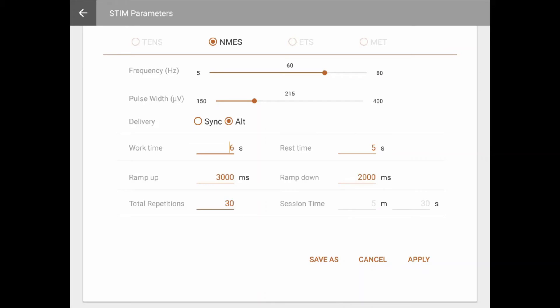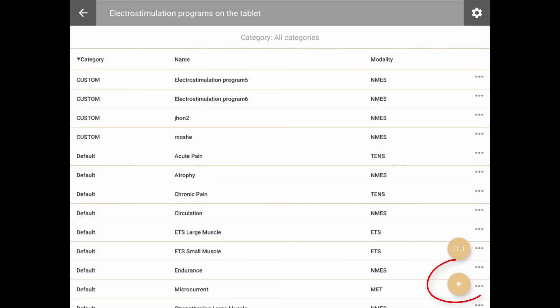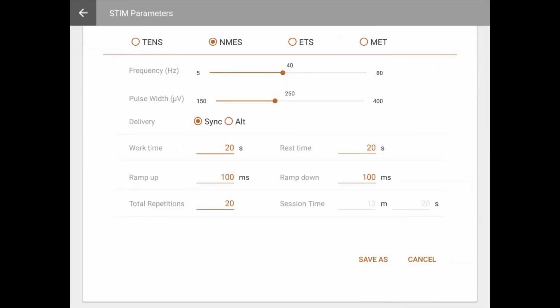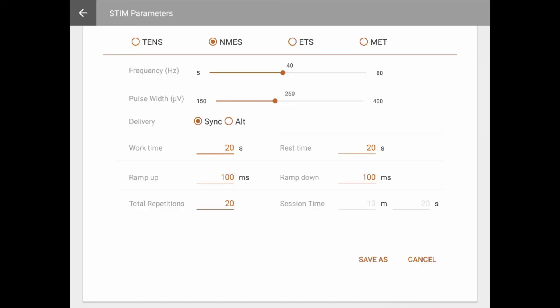To create a new program, click on the Plus button on the bottom right of the screen. The electrostimulation settings screen is accessible by creating a new program or editing an existing program. In this screen, you can set the frequency and pulse width values, and adjust the session duration, timing, and phases.